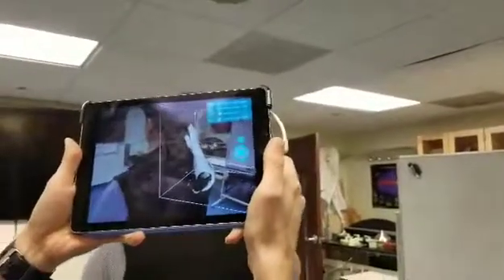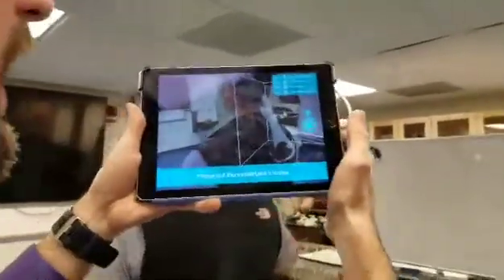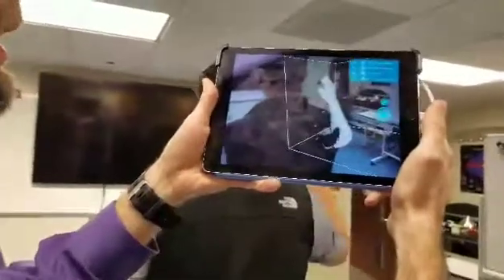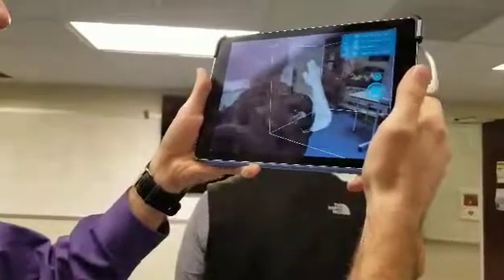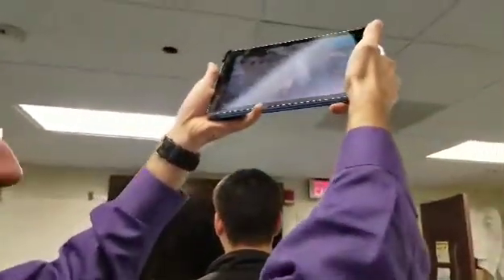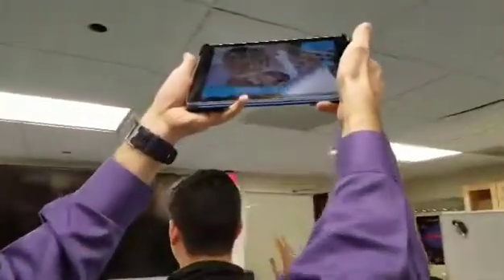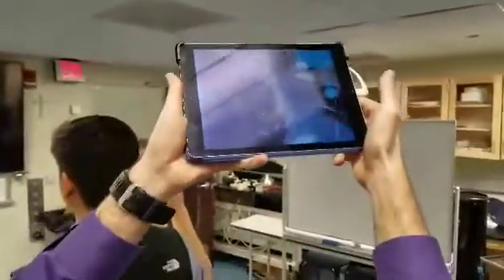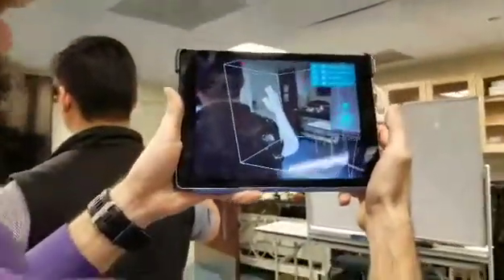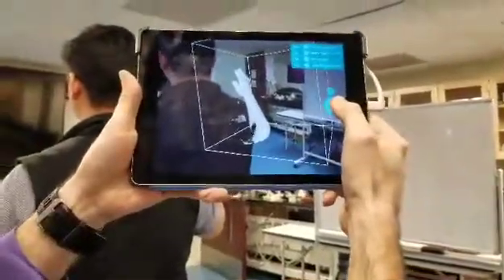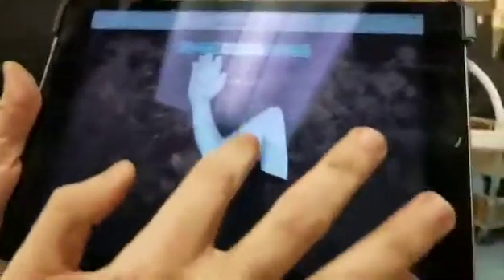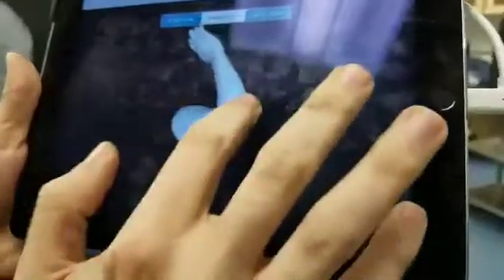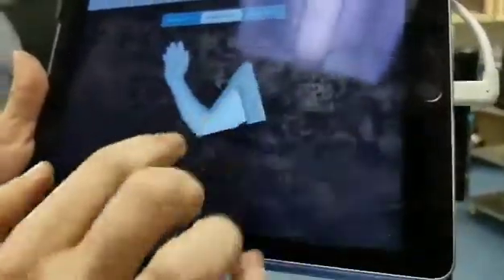If I keep trying to go all the way around him, I'm going to lose the view. I can put the model back into view and it should pick it right back up. If I really need to get a 360-degree scan, I can raise the scanner up way high and keep Philip's arm in view and walk all the way around — but I don't need to. Philip can put his arm down. I stopped my scan and we can see that even though I didn't walk all the way around him, I still got a good scan. That's going to be good enough to get information on his whole arm.